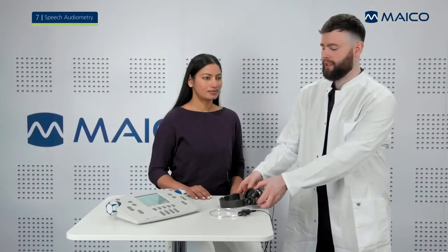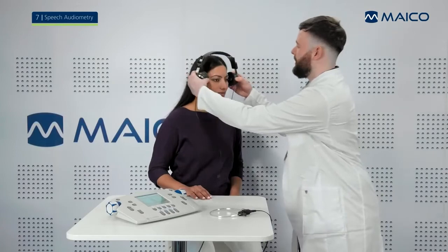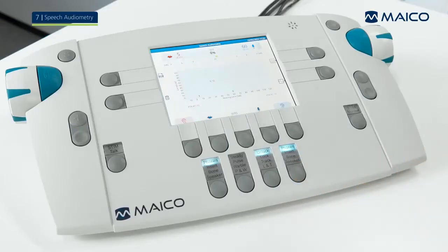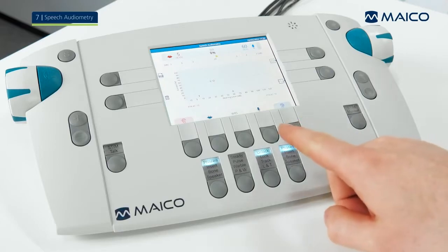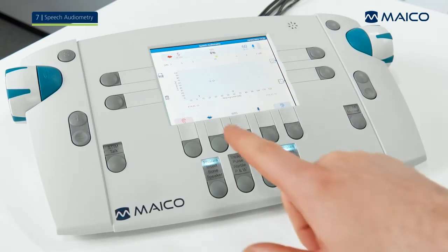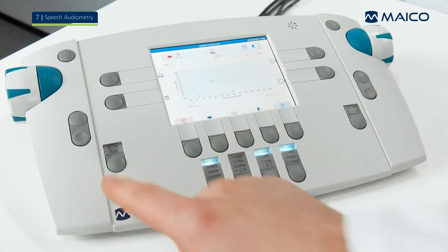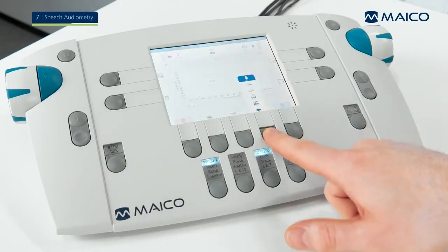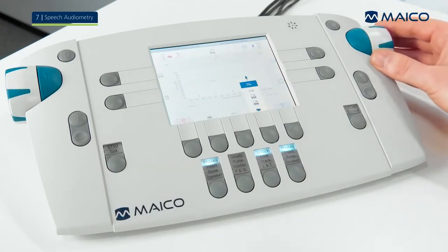Prepare the patient for the test by placing the transducer on the patient, and select the corresponding transducer on the device. Then select the ear for the channel and the input signal for the patient's ear to be tested and, if necessary, the masking signal for the other ear. The MA42 has a microphone input for living speech and an auxiliary input for connecting an external audio device.